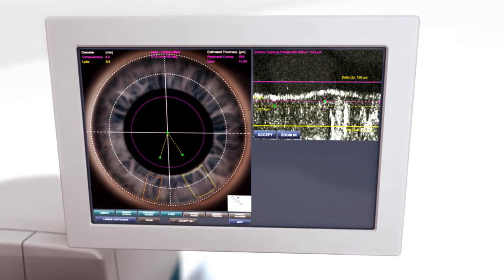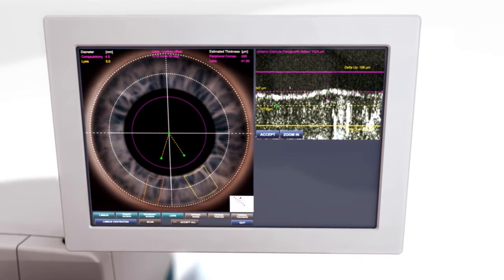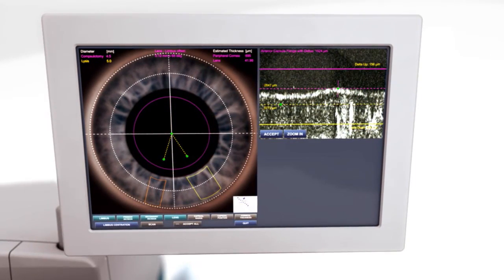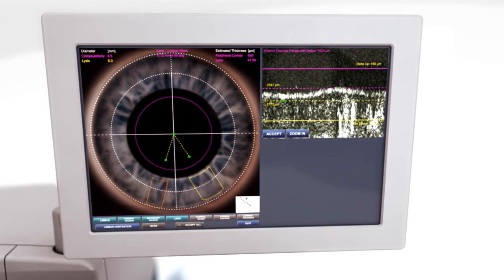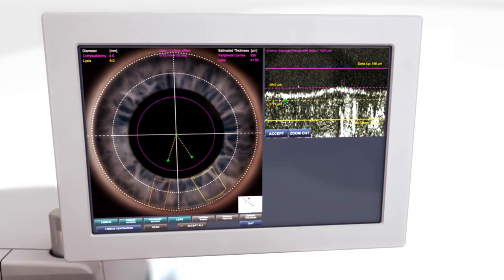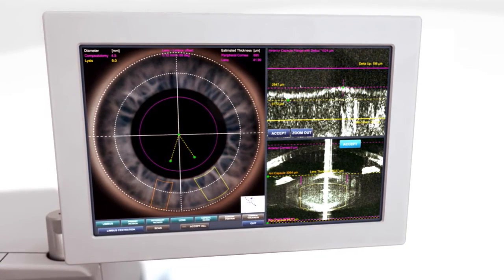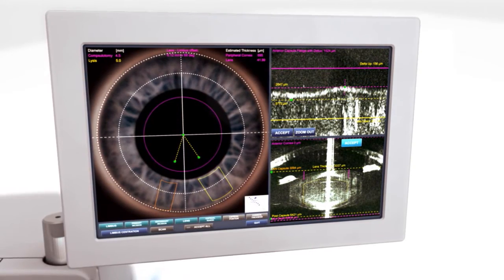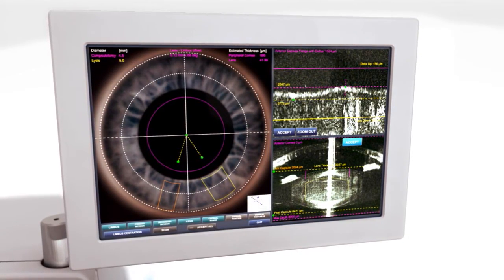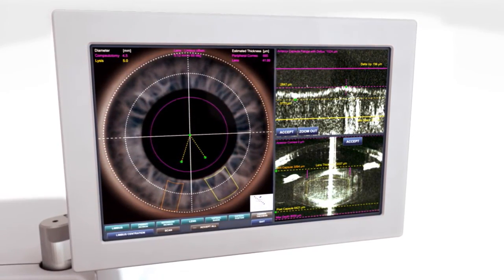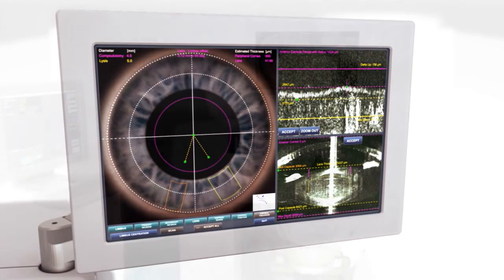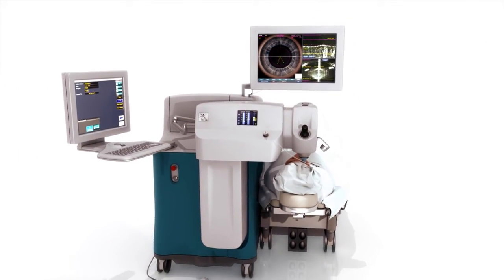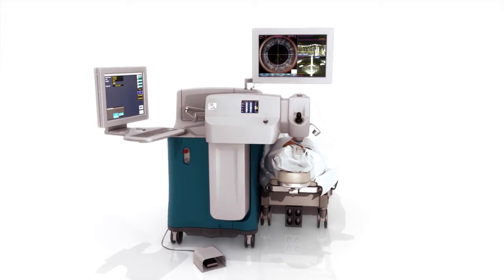The video microscope allows the surgeon to use the patient's eye as a visual reference when programming the laser's settings. Featuring an intuitive graphic user interface, a wide range of laser settings can be easily adjusted before and during surgery. These include size, shape and location of each incision, lens fragmentation and the depth of cuts.